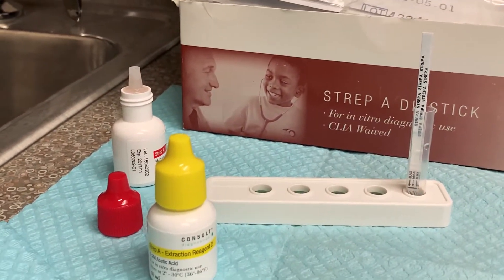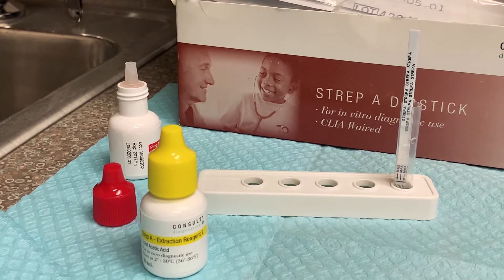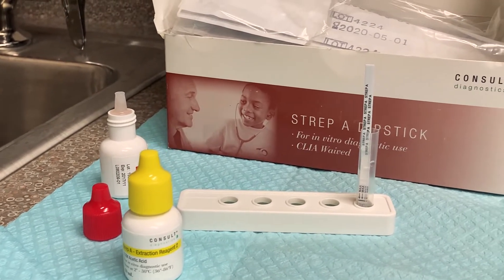One line is negative, two lines is positive — kind of like a pregnancy test, also known as HCG.